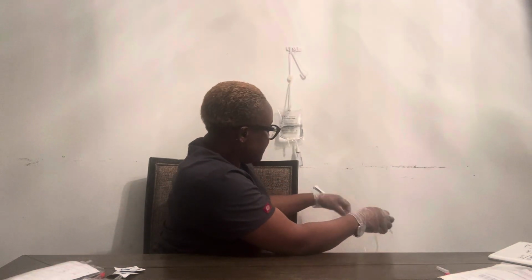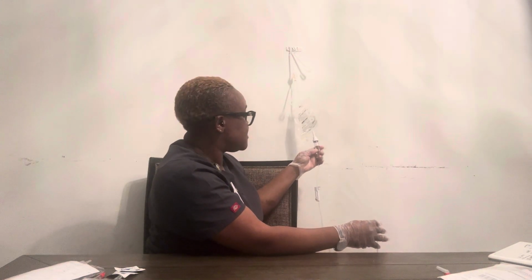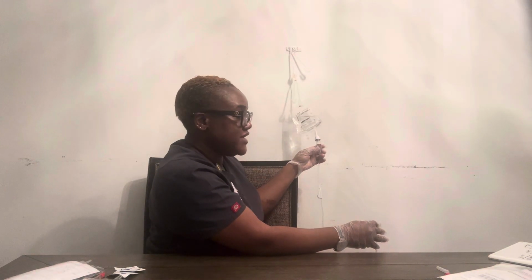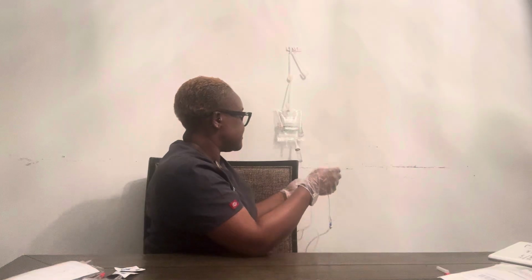Next, I need to confirm my drop rate. I am supposed to have 38 drops per minute. So I am gonna go ahead and count for 1 full minute to ensure that my infusion rate is correct.